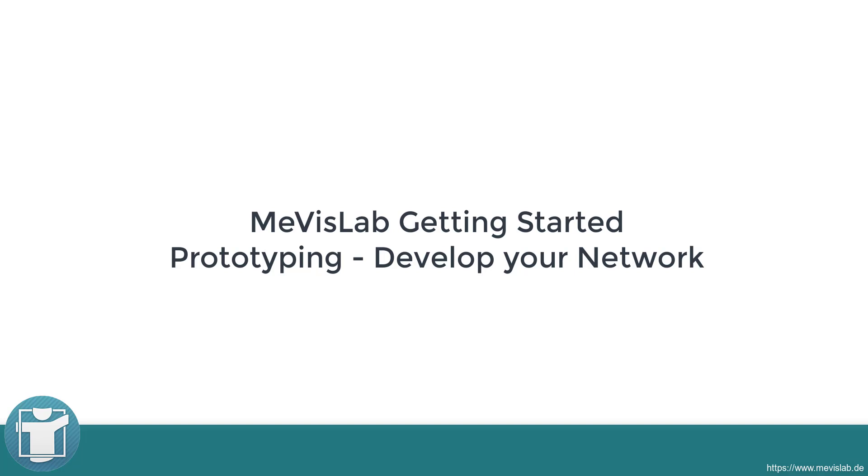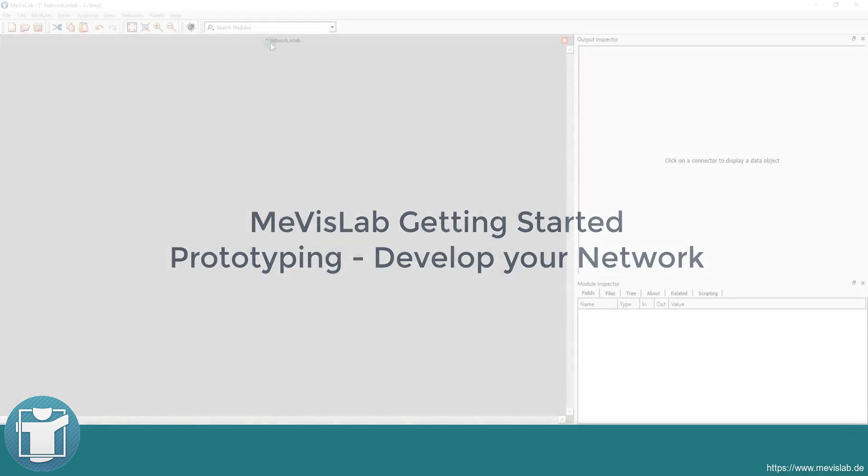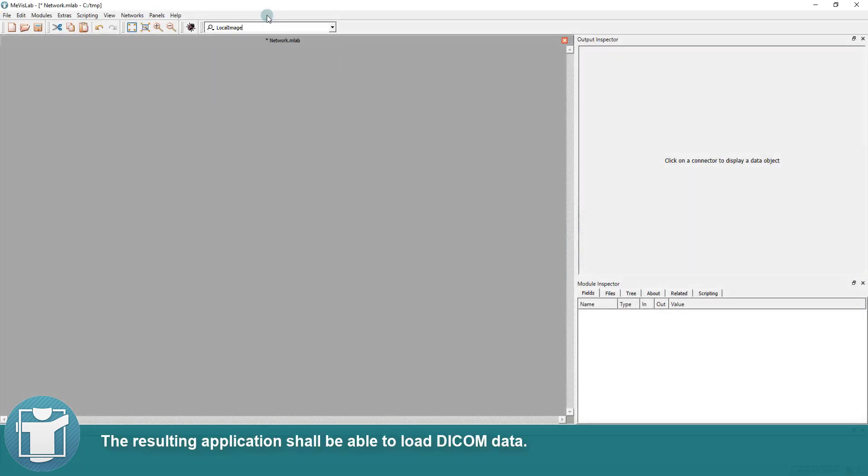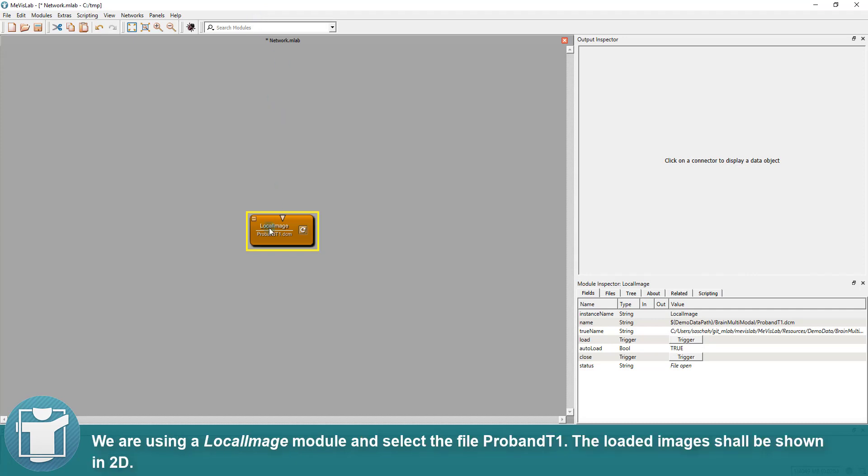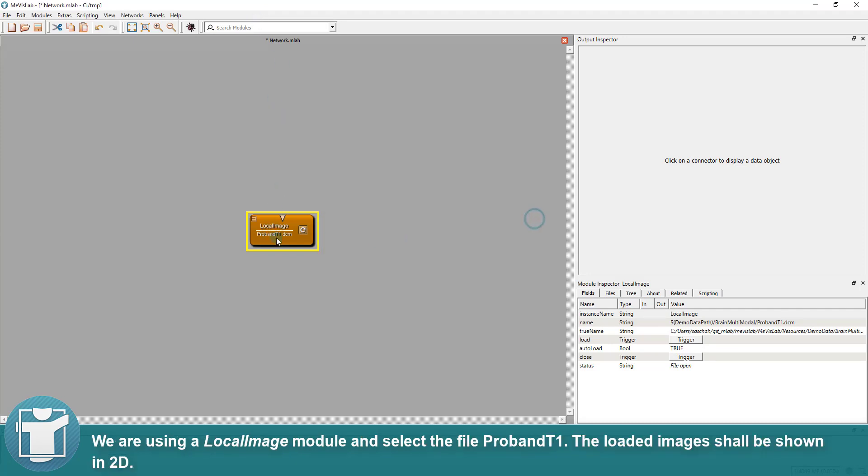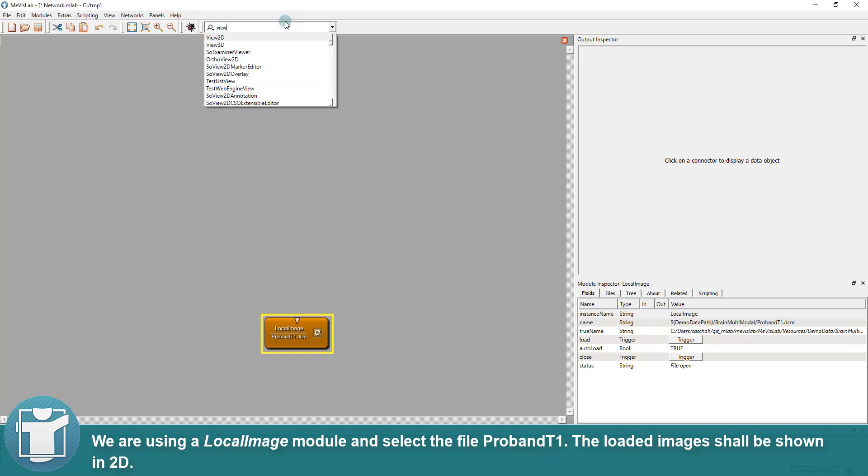In this video, we will create the network for our first prototype in MeVisLab. The resulting application shall be able to load DICOM data. We are using a LocalImage module and select the file ProbandT1. The loaded images shall be shown in 2D.